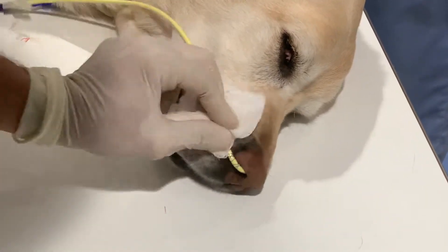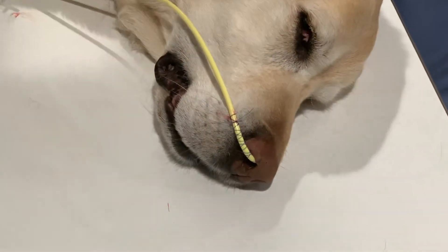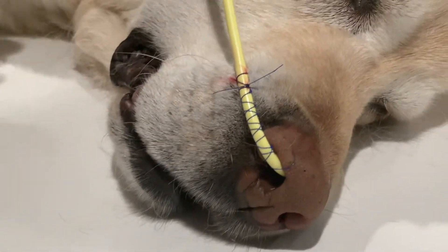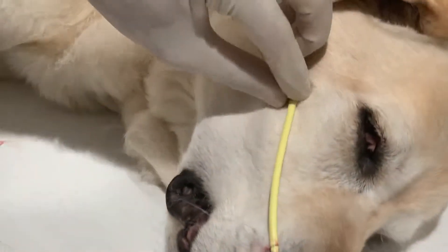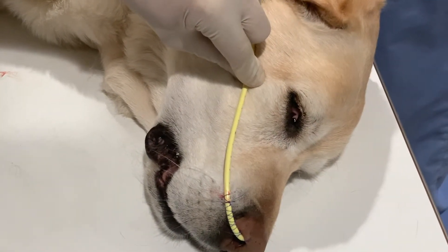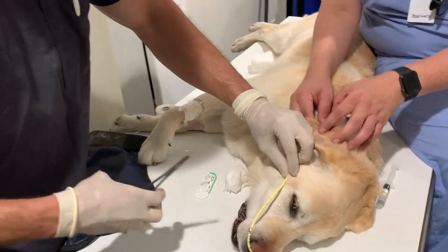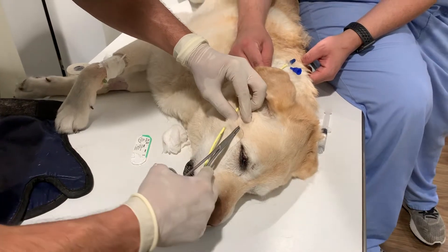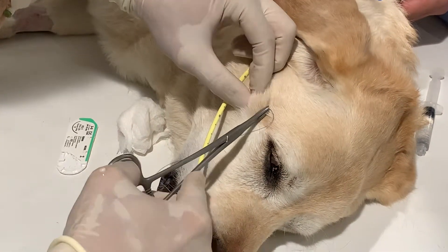This is about a 10 French feeding tube for a relatively large breed dog. We're going to place one more suture on the side of the cheek to anchor it one more time and then we're good to go. We're going to start getting Jackson on the way to health. I'm going to secure the feeding tube over the cheekbone — the zygomatic arch. Again, I'm pretty aggressive with securing these — I want to make sure they definitely don't come out.